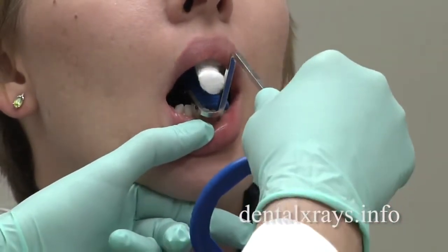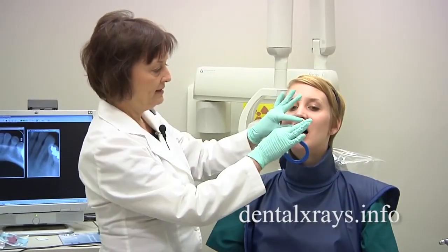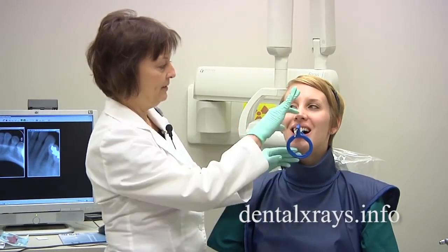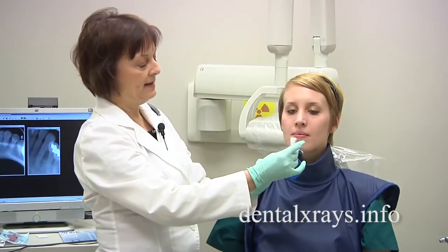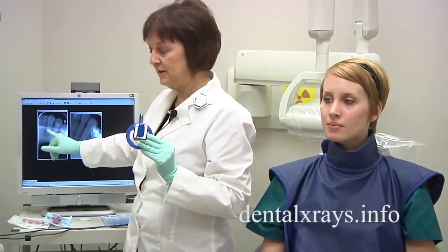Sometimes you have to readjust it a few times to make it work. Slide this in and then you're going to put your cone in and get the perfect picture. When I say roll the bar up before she bites, it helps eliminate a lot of foreshortening.